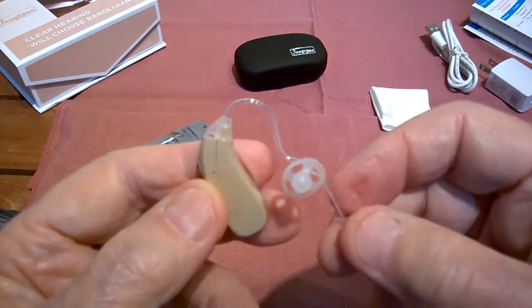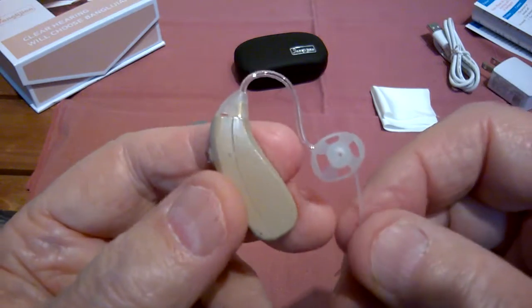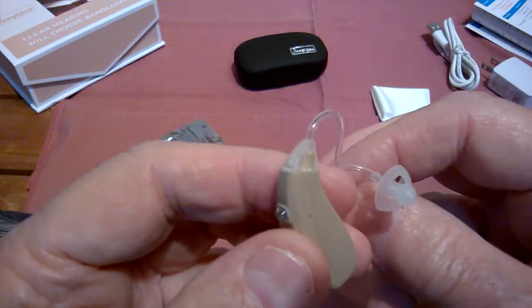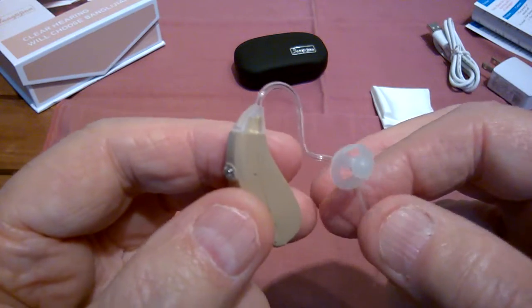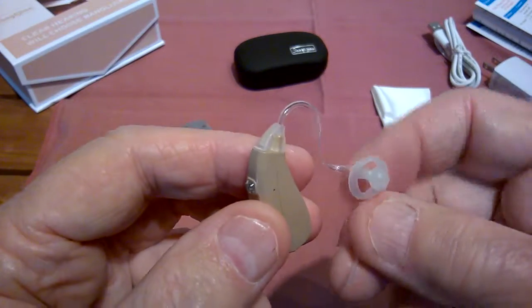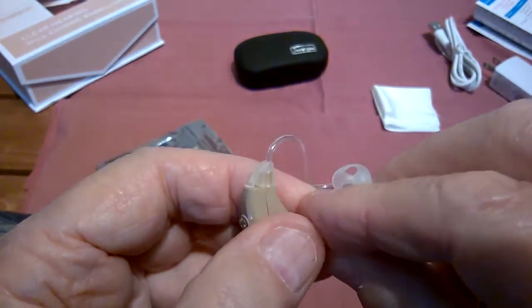Now, this little piece, you can cut it if you want to, but before you do, try them, and I think you'll like it to leave them, because this is designed to pull it out of your ear if you get it in there tight. But not only that, this will fit around your earlobe inside and help keep it in place.